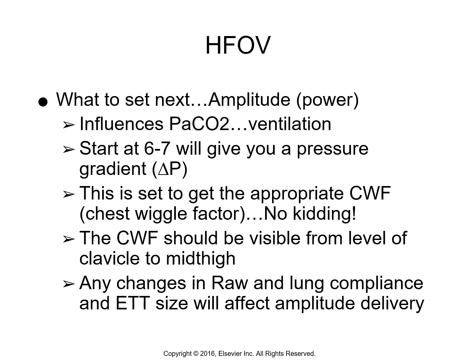This may take an amplitude of like 60 to 80. In the video that you're going to watch at the end of this lecture, the videos are geared for peds. It's like a 13-month-old patient.